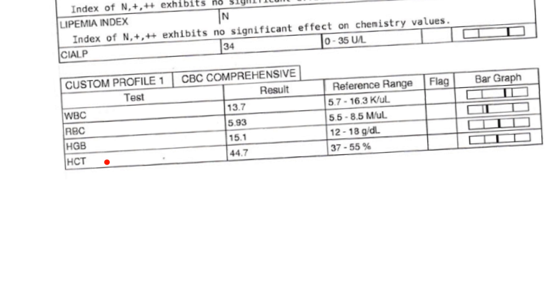The result for this dog is 44.7 — look how close that is to our convention of 45%. The reference range indicates what's normal for dogs: 37% to 55%. There are no flags because this value falls within the normal range. If it was high, the flag would read capital H; if it was low, capital L. And there's a visual indicator showing that 44.7 falls within the normal range between 37% and 55%.